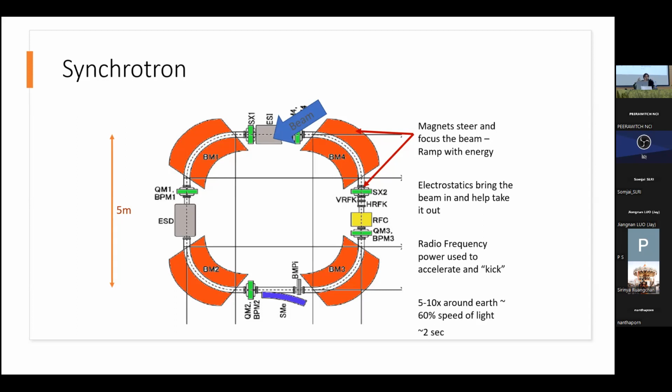If you shrink your synchrotron, make it as small as possible, you just don't have as much space to have these quadrupoles and everything else to refocus. So these bending magnets, these dipoles, have to be properly tuned and machined so they can act both as a dipole and a quadrupole, so they can actually focus the beam for you as well. So again, the advantage of making something smaller comes with some disadvantages. It makes the engineering and the accelerator physics part that much more difficult. But as long as you think about it ahead of time, you can deal with that.